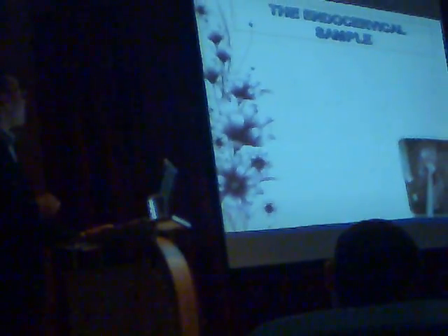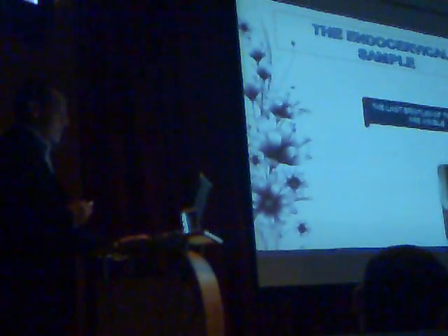Now, how do we introduce the brush? The brush is introduced into the cervix under certain conditions. Observe. The first one, the last bristles of the brush are visible. Don't introduce it so deep. The last bristles must be seen.